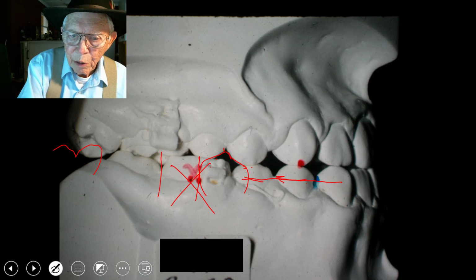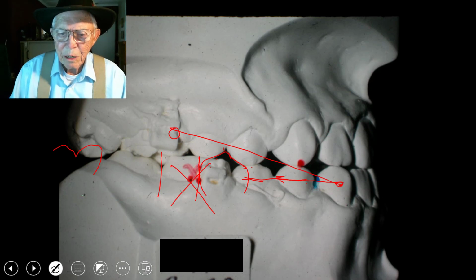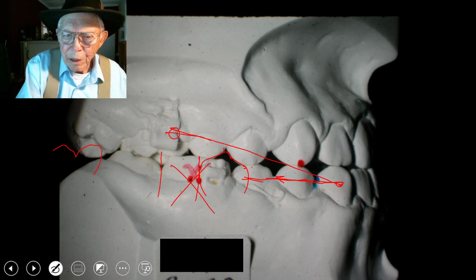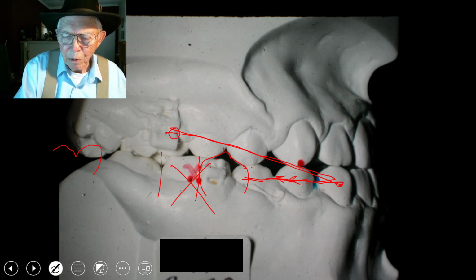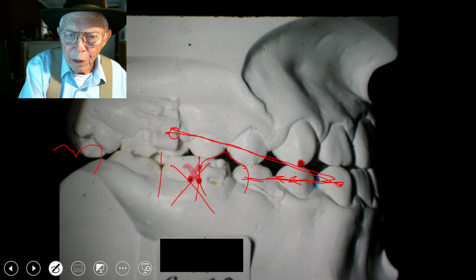And now we're going to hook up Class 3 elastics up here, and we're going to pull down against this with Class 3 elastics. So part of this correction down here will be as a result of this Class 3 elastic pulling back on these teeth up here, and they'll come back to there. And we could do the whole thing from that point if we need to, and then we'll be pulling this forward down here.